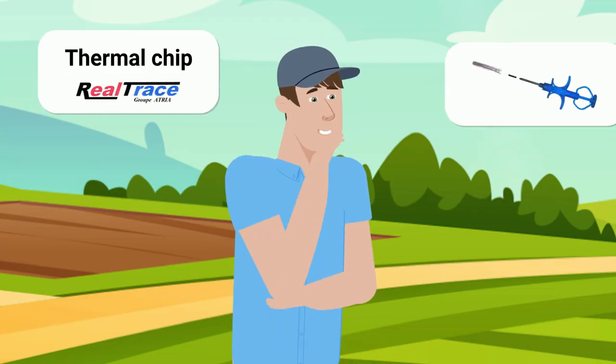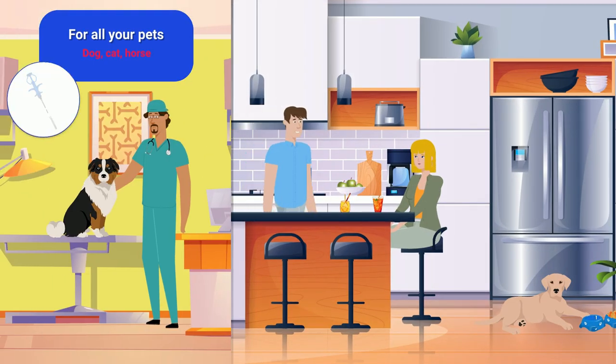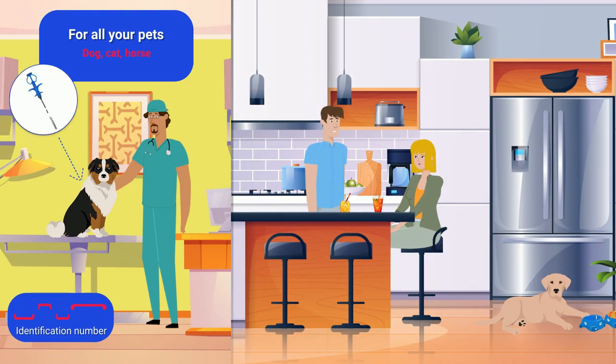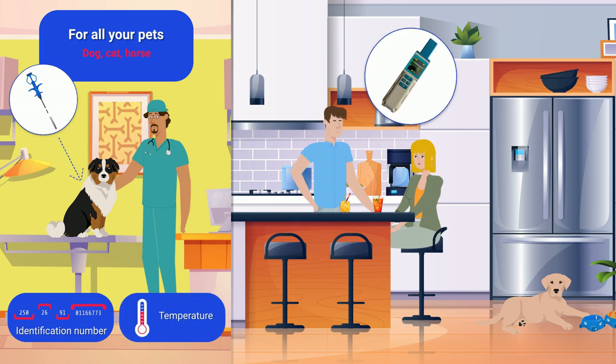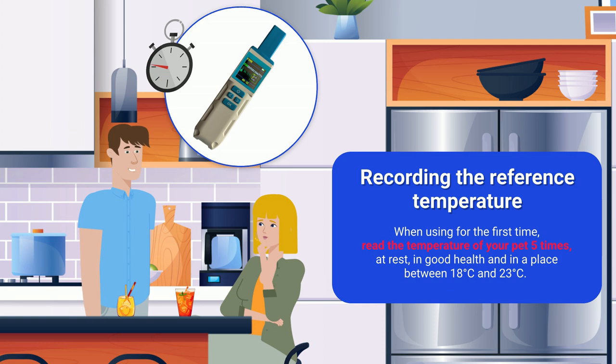Your dog doesn't have the Atria Thermal chip? It's a chip that your veterinarian implants in your animal, which in addition to identifying it, gives you its temperature. With this little scanner, in two seconds you know if the temperature is higher than your animal's reference temperature.